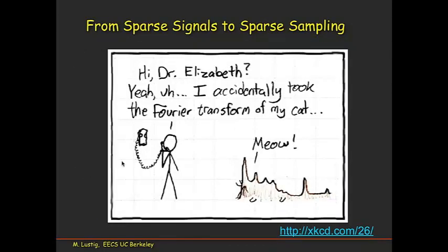Okay, so how do we move from sparse signal to denoising through sparse sampling? We're going to do it through the Fourier transform. Okay, how do you know this is imaginary? That could have been a question, but I'll say that the spectrum is not symmetric, so the k-space must have an imaginary component. All right? Okay, let's move on.